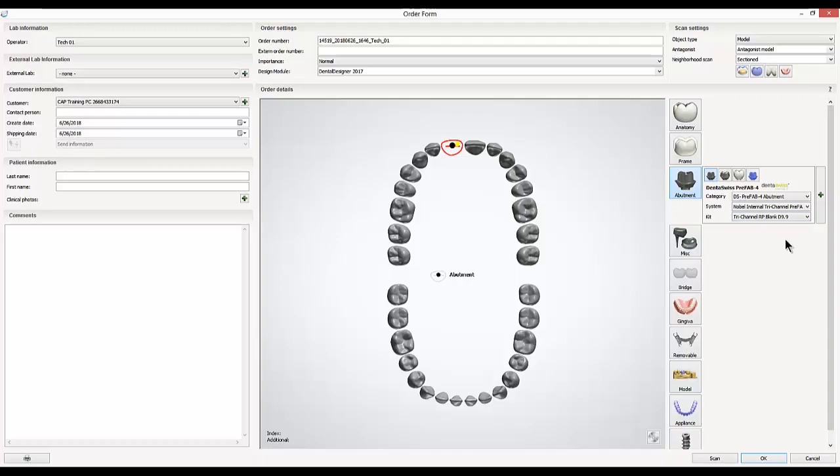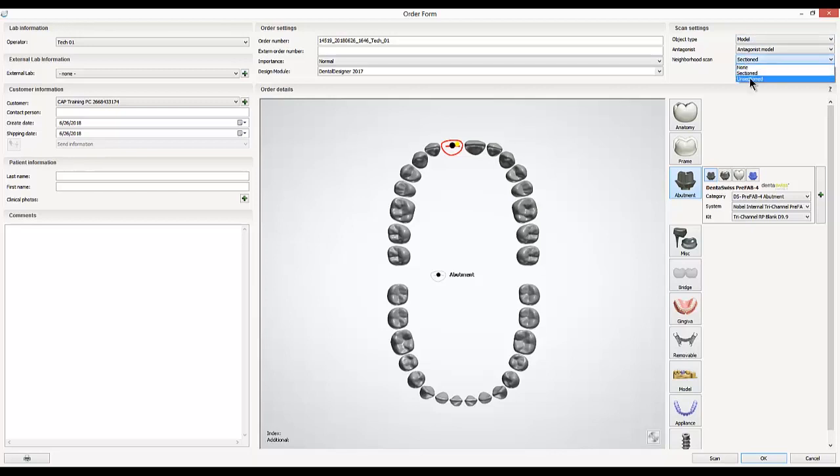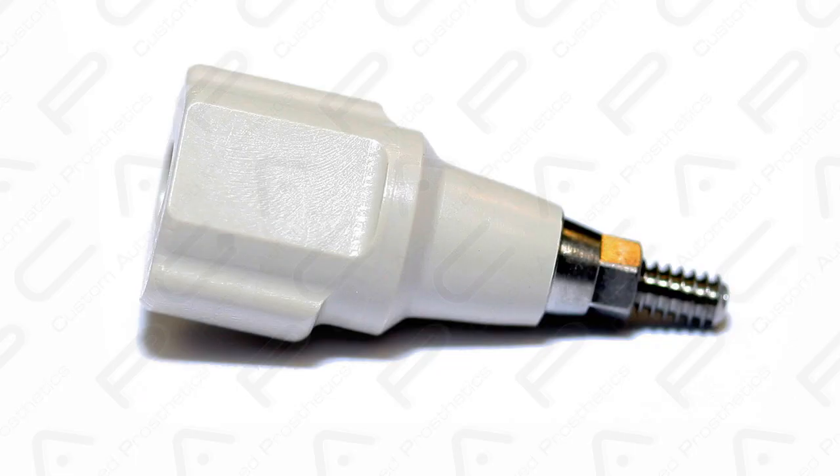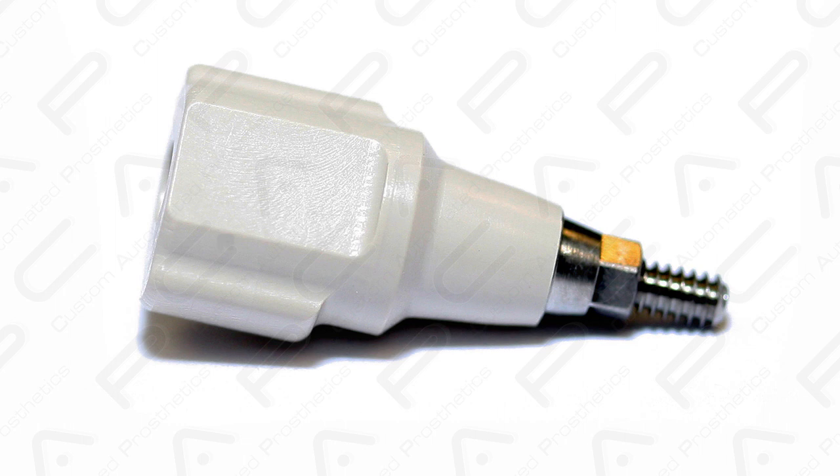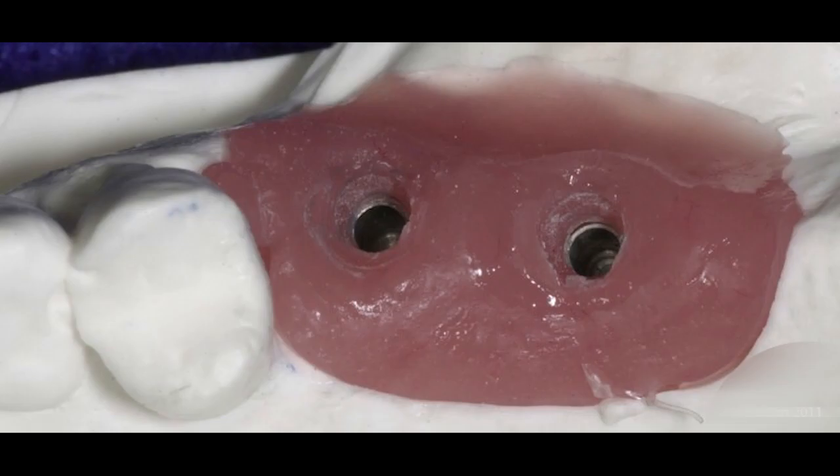After setting up your implant system, we'll go to the top right for scan settings. In this case, I am working off of a model with an opposing model, and to 3shape, every implant case is going to be considered a sectioned model, even though it's not sectioned in the traditional sense. 3shape always considers implant cases sectioned because you're going to have one scan that involves a scan flag or scan body, and another scan that involves a soft tissue, typically.